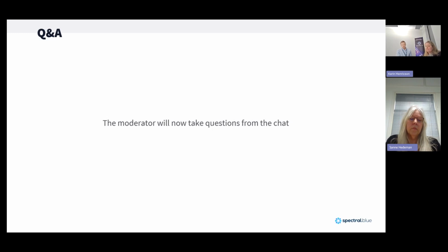Yeah, that's a valid point. Like presented, the UV radiation is invisible to the human eye. So from a UVC device, you can't know if it's active or if it's working at 100%. But from spectral blue devices, you can see with your bare eyes whether it looks the same as yesterday. If there's a problem, the LEDs would go blank.